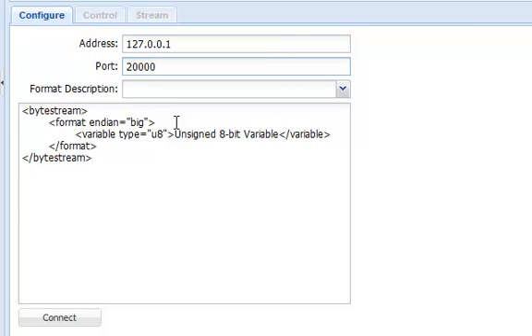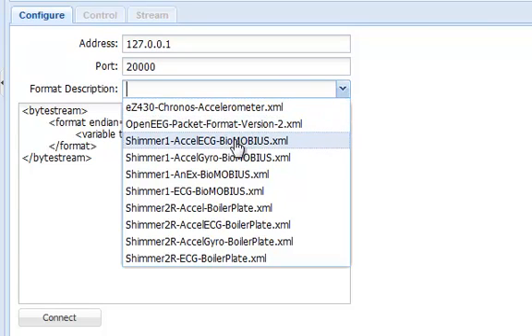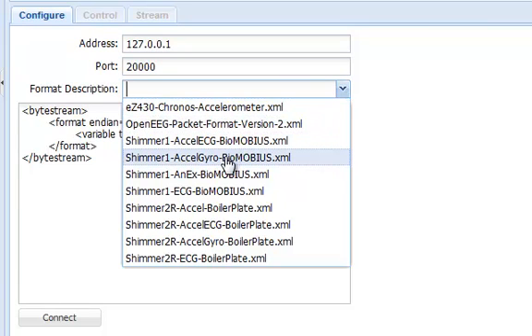As part of the SensorMonkey service, we have uploaded a set of format description files for some of the more widely used Shimmer firmwares. In my case, I'm using a revision 1.3 Shimmer with the Biomobius AccelGyro firmware. So I can select the Shimmer1-accelgyro-biomobius.xml file.